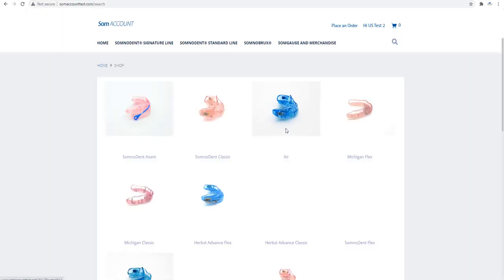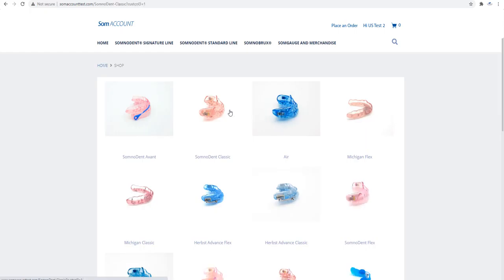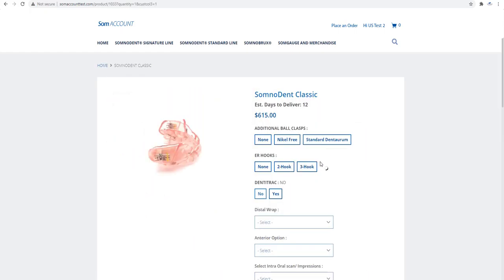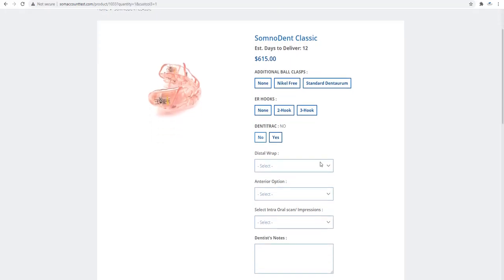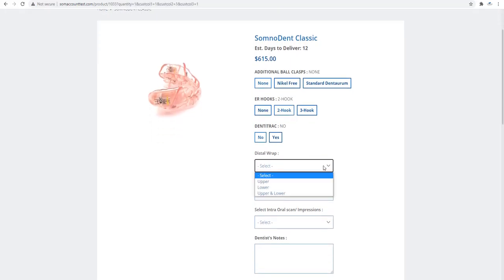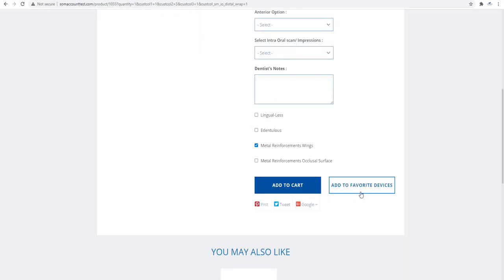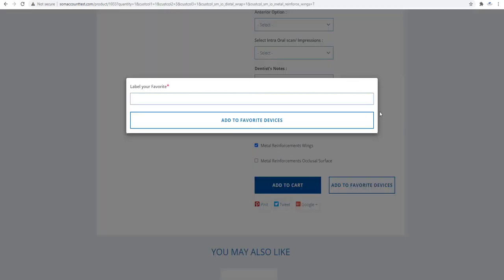As an example, click Somnodent Classic. Select the different options that you would like to be saved to your favorite device. Click Add to Favorite Devices.